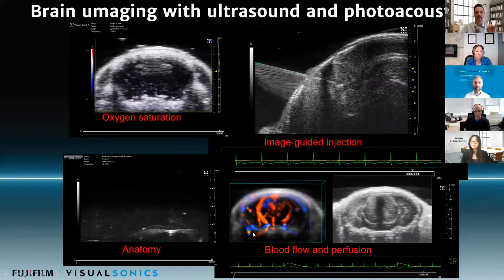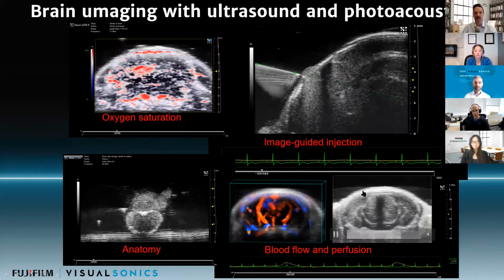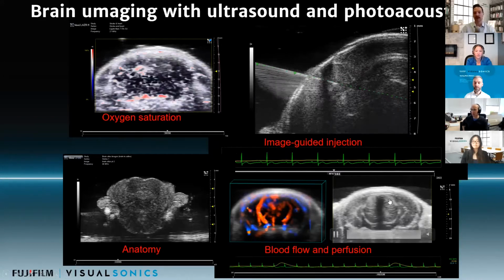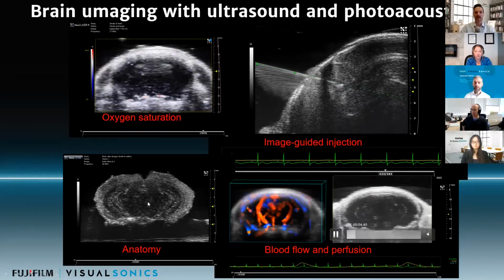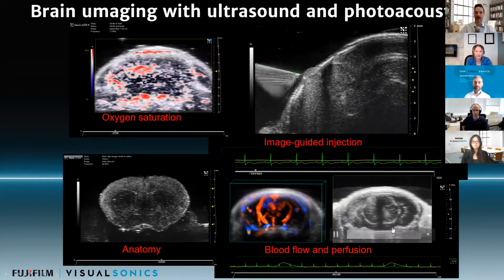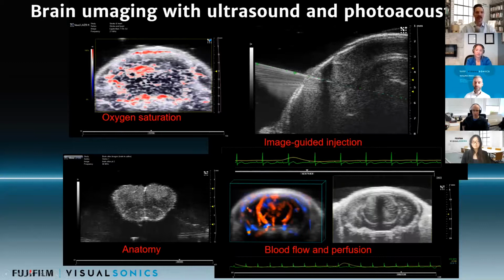Both blood flow looking at Doppler, and then the right-hand image is looking at blood flow. Again, the bottom right image is skin and skull intact, and you're seeing this absolutely gorgeous vasculature coming in. This is a stroke model, actually. So you can see on the right hemisphere there's impaired flow in that case.